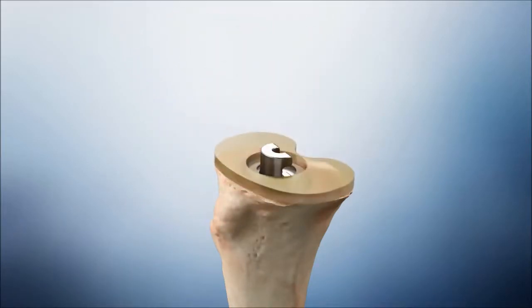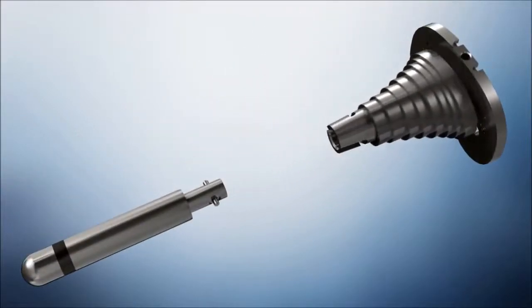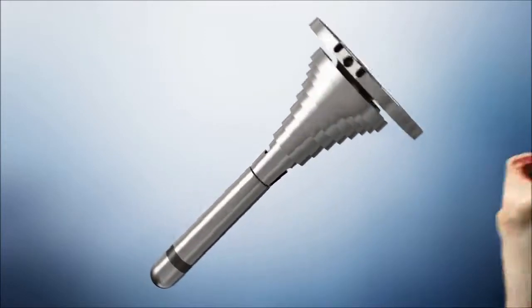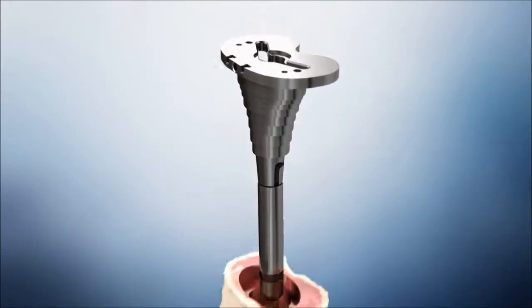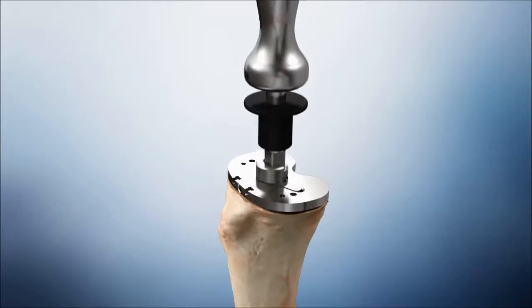Utilize the tibial view plate to assess tibial size. Assemble the tibial tray trial with the appropriate size sleeve trial followed by the stem extension trial. Position the tibial trial construct into the prepared tibial canal. The base plate should be positioned to provide the best coverage of the tibial condylar surface. Utilize the keel punch to aid in fully seating the trial.